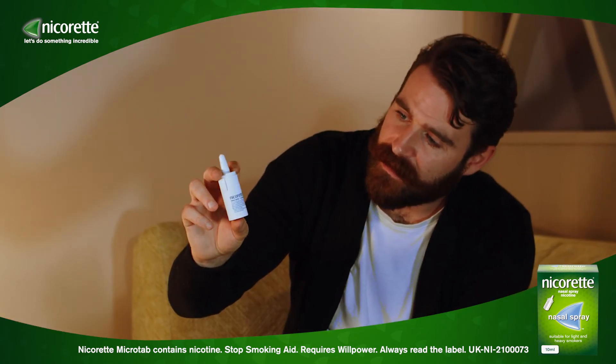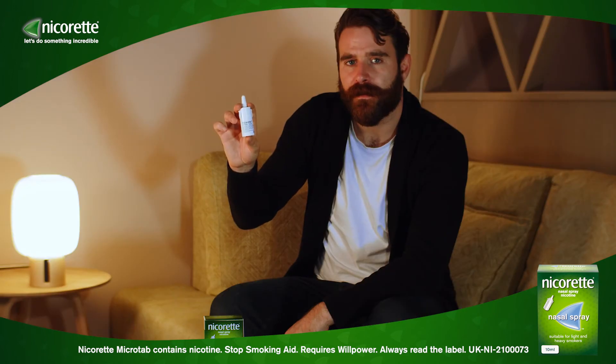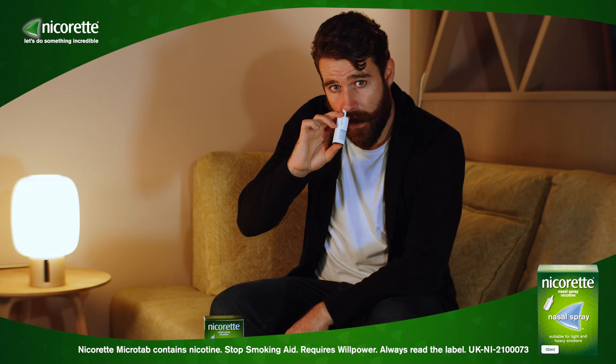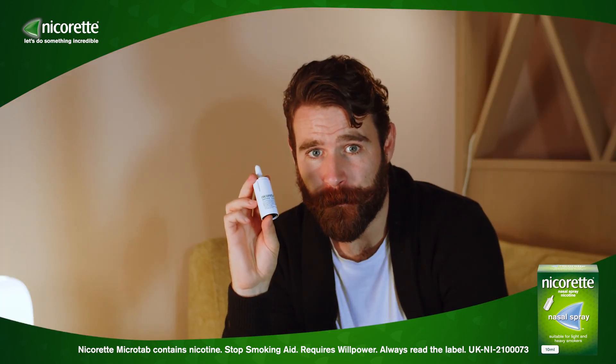Place the nozzle between your first and second finger with your thumb on the bottom of the bottle. Insert the spray tip into one nostril, pointing the top towards the back of your nose, and press firmly and quickly. Then insert the spray tip into your other nostril and repeat the process.